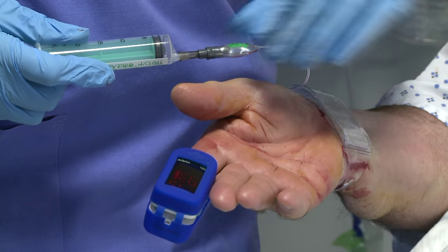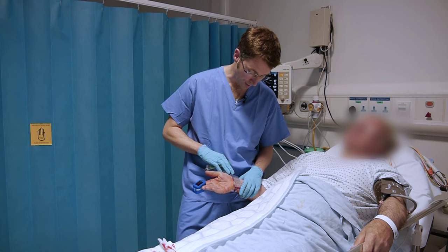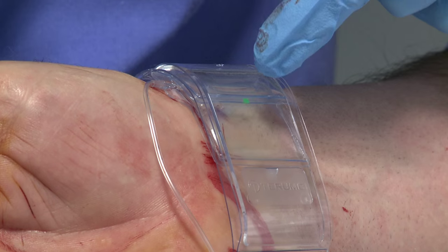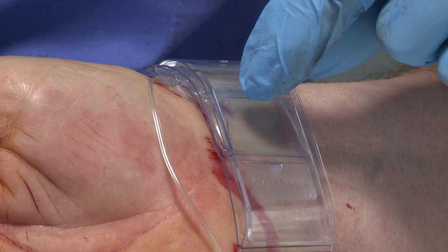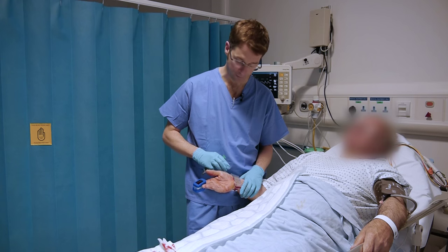We've now withdrawn down to nine mils of air. Importantly, we have to just confirm that we have continued occlusion at the skin surface and no evidence of blood loss. We actually have a very nice clean site at this point. So here we have achieved patent haemostasis.